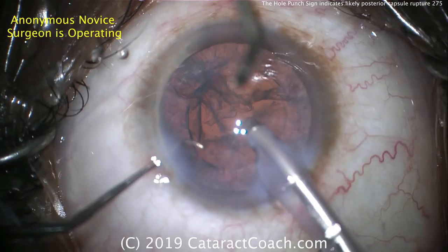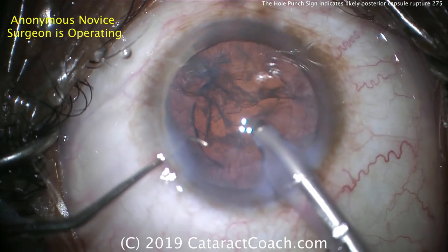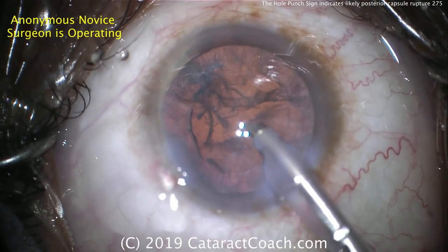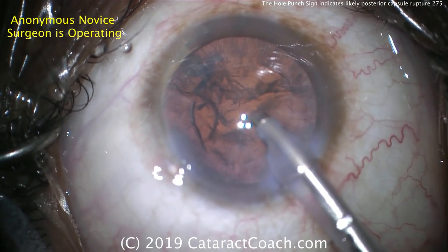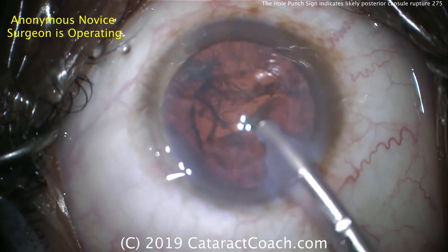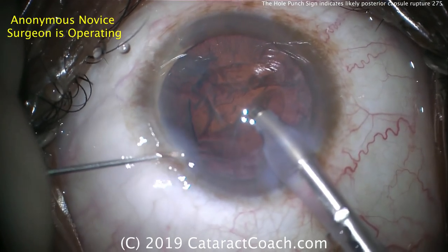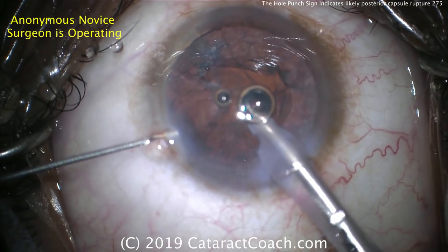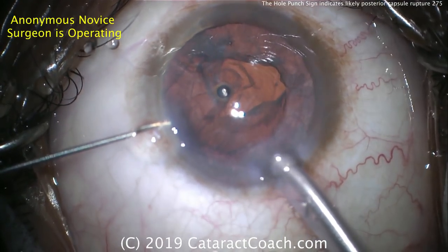At this point, do not come out with the phaco probe. You can see a third hand — that's the senior doctor who's teaching. This is a great idea: keeping the phaco probe in the eye on position one to keep the anterior chamber pressurized. Do not pull out of the eye. If you pull out now and depressurize the anterior chamber, a lot of vitreous will come forwards. Getting a dispersive viscoelastic in there to tamponade things and pressurize the anterior chamber — that's a good move.